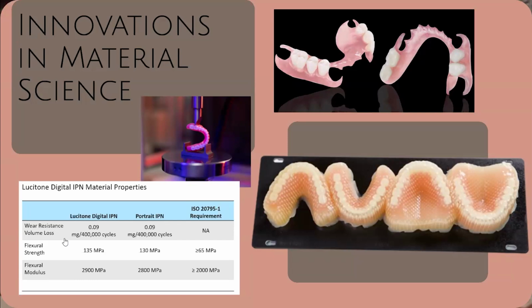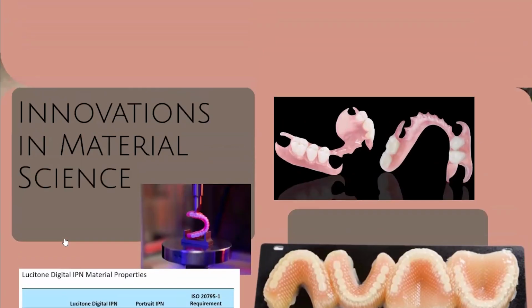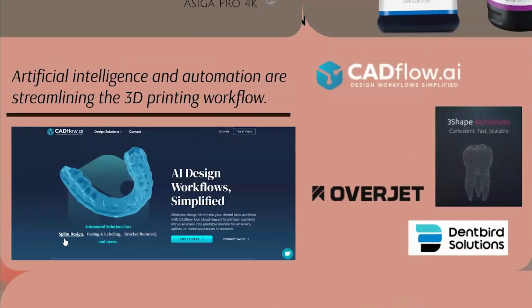And again, these jetted resins, this is the TrueJet, the Trusana. One of the coolest things about this workflow is that there are no supports. This thing actually prints the denture within a bed of goop, right? And that goop just washes off, but there's no sprues to disconnect. So when it comes out, there's not a lot of handwork.